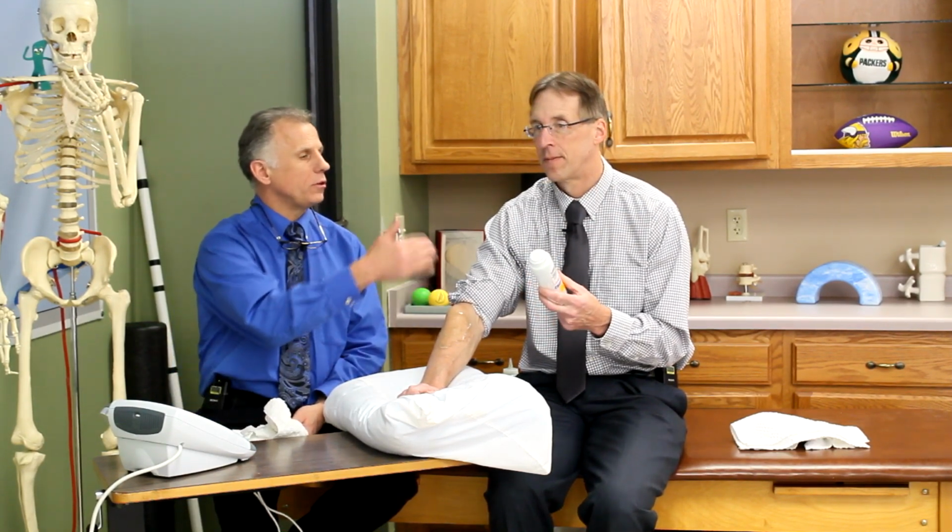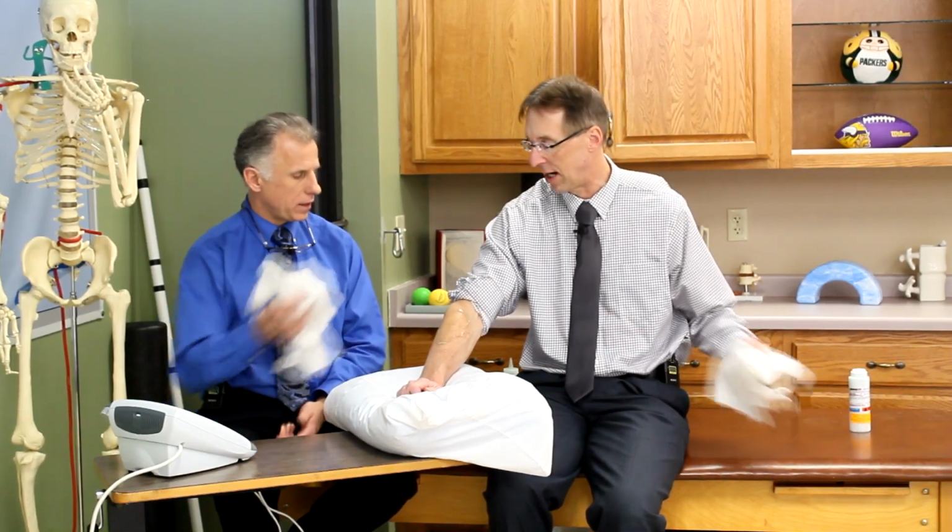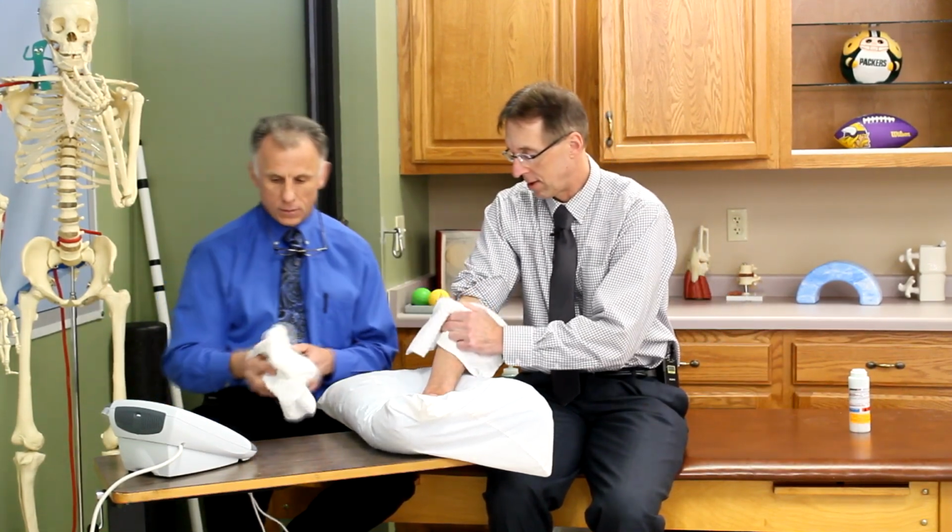Right, and it's something you'll use in coordination with some stretching and exercises, with everything else. Believe me, you don't just come in to get phonophoresis and leave. We're going over all the other things too that you're going to do, maybe massage. Here, you can wipe your arm off.